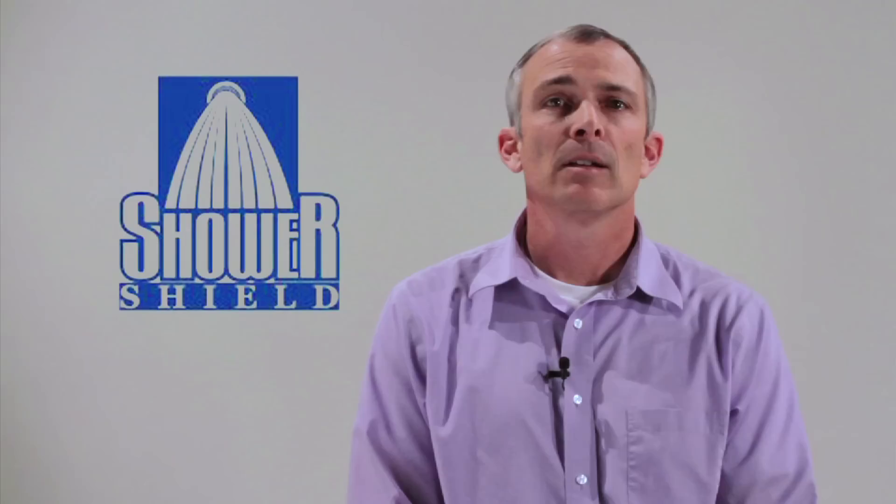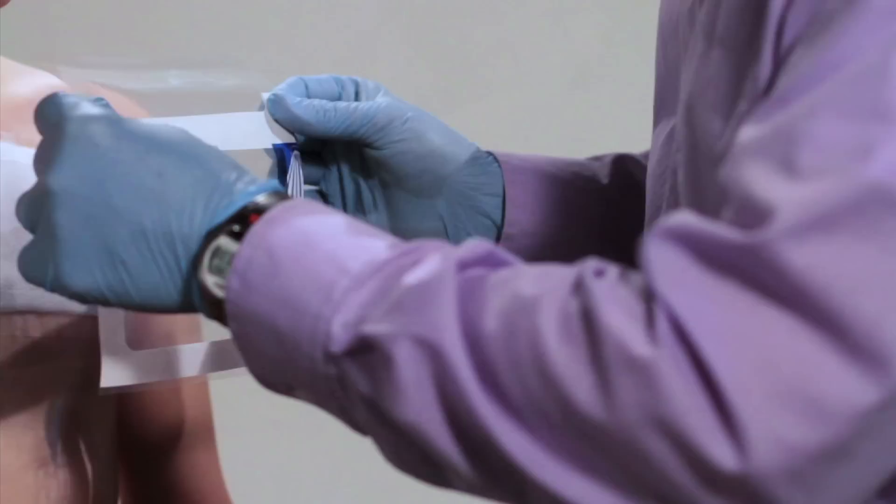To apply the dressing, find the top of the dressing and peel back the wax paper only on the top edge. And apply that top edge about an inch above the site, making sure that you get a really good seal.